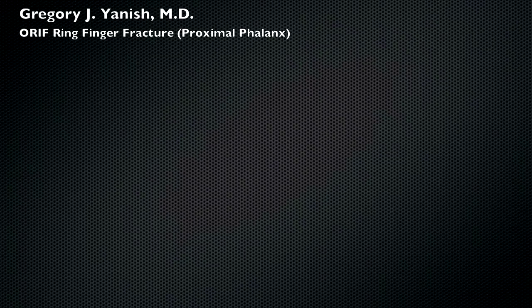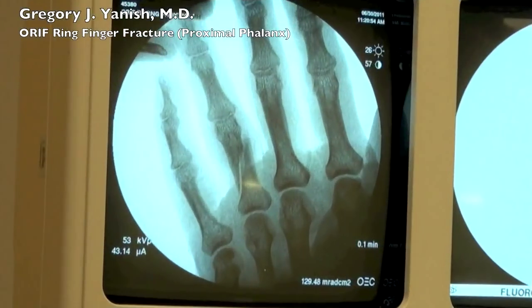Hello, this is Dr. Janusz. This video is going to be an open reduction internal fixation of a ring finger fracture.